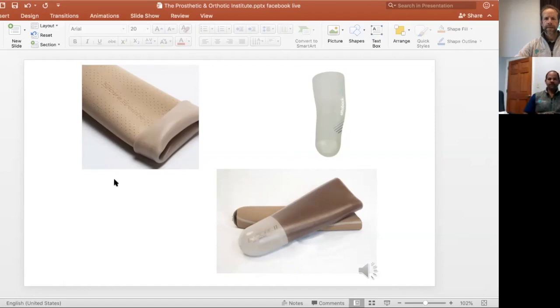Okay. And how long do these typically last before they're replaced, or does one last longer than another? Great question. Patients ask this quite a bit. When we look at the silicone liner, which I told you earlier is more durable, less stretch, thicker, and less skin friendly, what we get with that is a liner that's going to last a lot longer and can stand up to high activities. Mountain bikers, hikers, and athletes will use this material for their prosthesis because of the features it offers, and it's going to have more longevity.